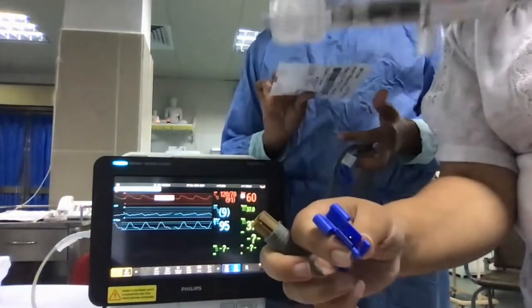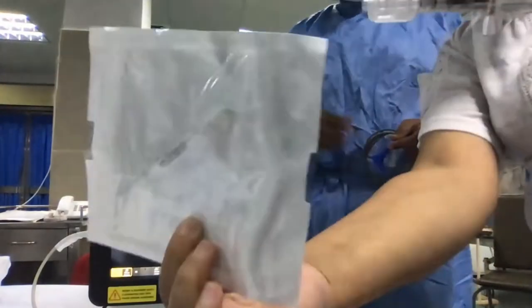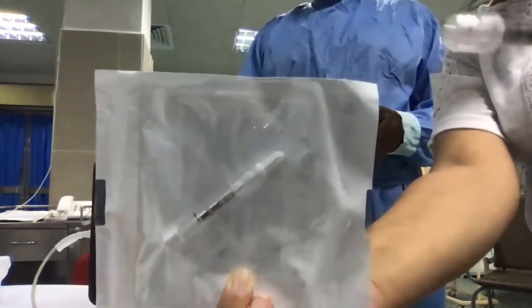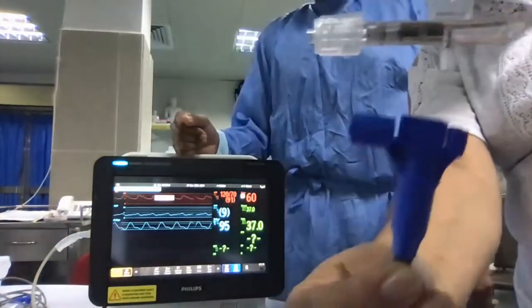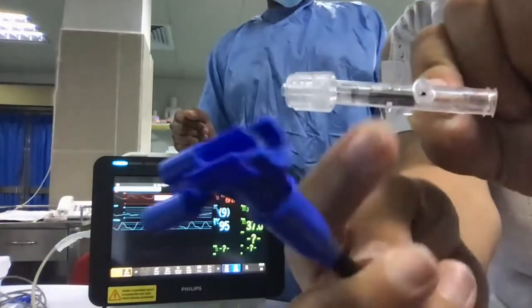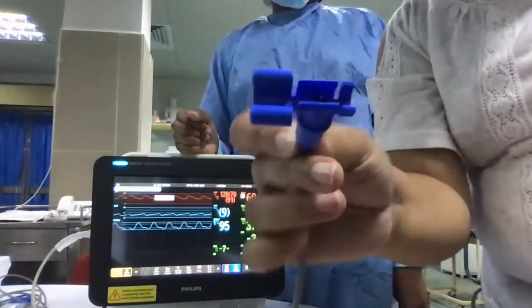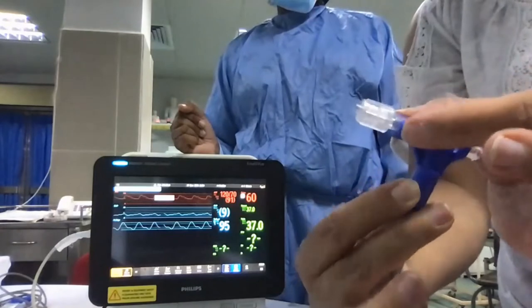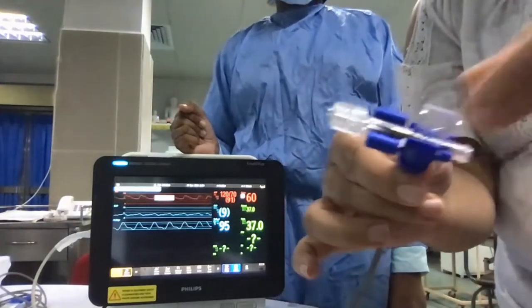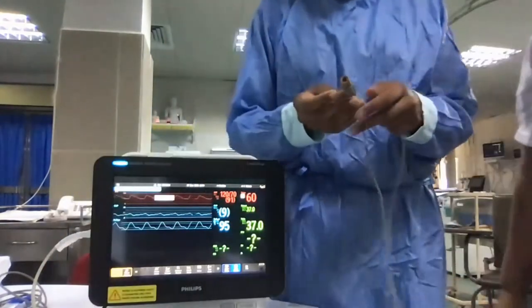So this is the injectate housing, which comes in a sterile pack. It is single use. So this is the single use sterile pack, the injectate housing. This is the one that should go into this blue color temperature sensor. There is a receiving hole here, and can you see there's a lead looking pin inside. So it should go in and fix there, then you will hear a click. You will hear a click if it fixes properly. There is a bigger end and a smaller end, so it nicely fits into this side. And all our cables are color coded, so you won't get confused.